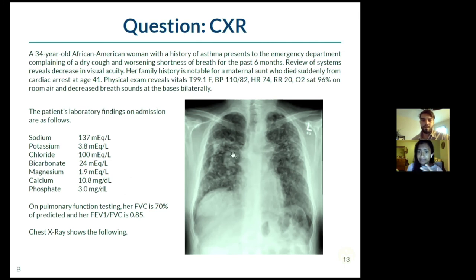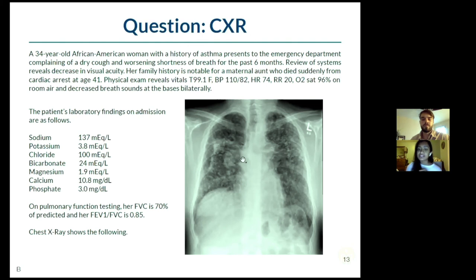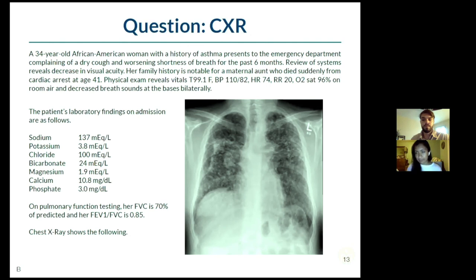Bilateral hilar lymphadenopathy - that's the key thing I'm looking for. I can see that this hilar area is a little bit enlarged. This consolidation here can throw people off - this is not hilar lymphadenopathy, but this definitely is. And the other thing: interstitial fibrosis. These lungs just look junky - sarcoid often has an interstitial pattern on top of hilar lymphadenopathy. If you see that hilar finding, that should be your first thought.